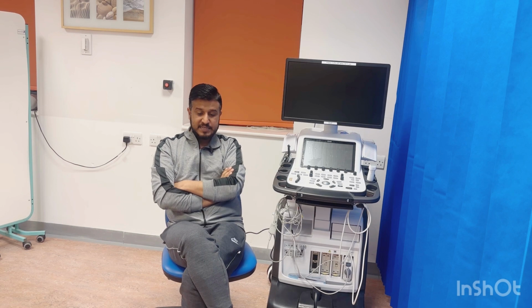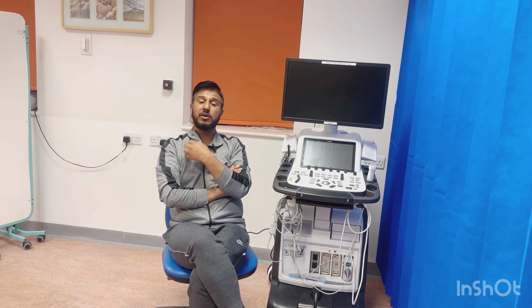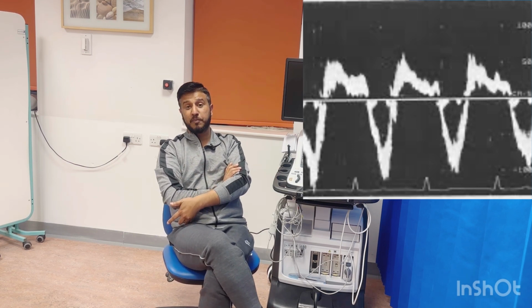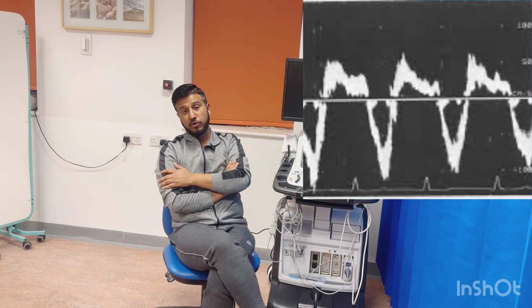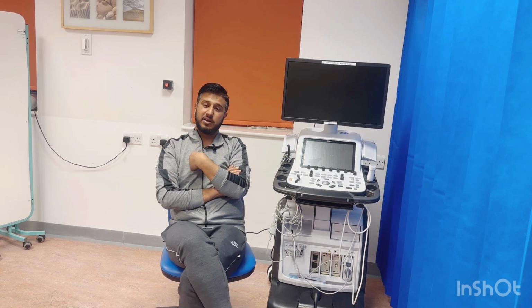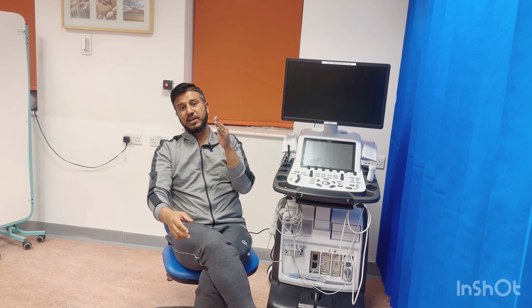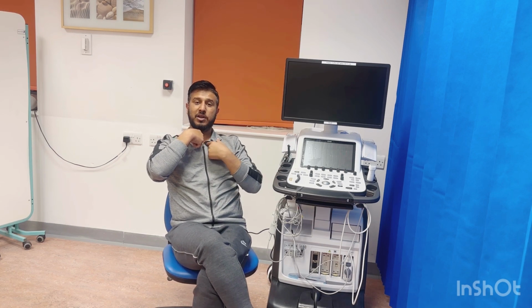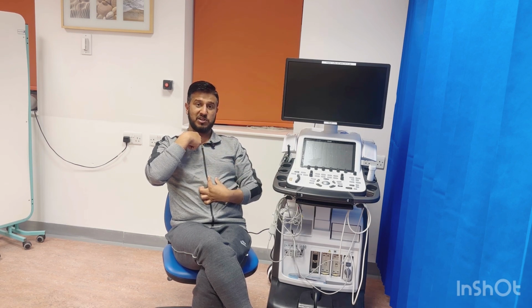So the next is what I call indirect parameters, where we see the reversal in the descending thoracic aorta or abdominal aorta, or some people do the right femoral arteries to look at the flow reversal. That's a very easy one. You just go into the arch, okay, and put the color on the descending aorta. You will see the blue flow going in systole, because your probe is here, so the flow is going away from you, okay? Actual flow is going away from you because the arch and descending aorta go downwards, okay?